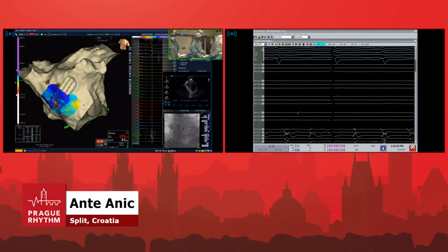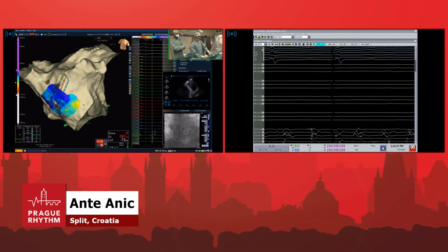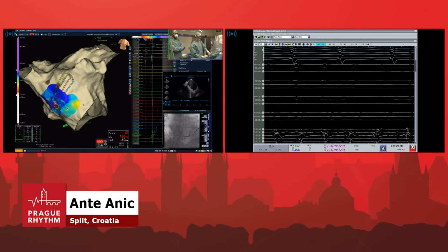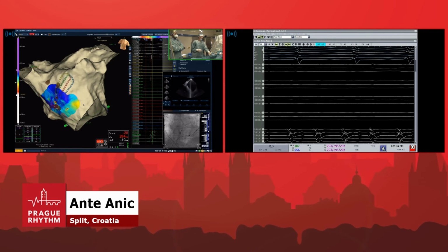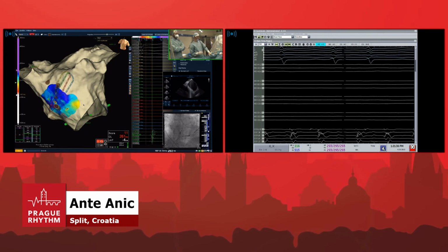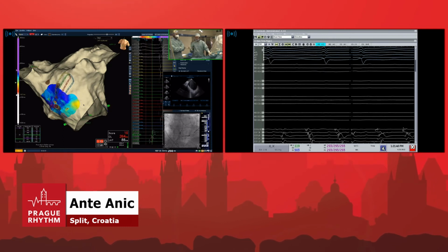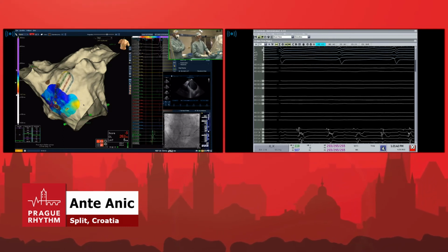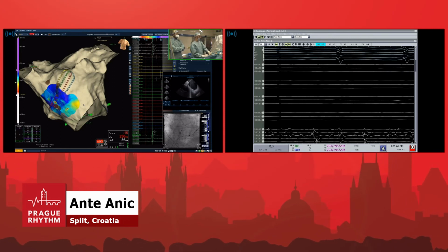But I agree with you that, and it's an operator sense. You have to have a good sense of how far you are from the node. And I do agree that we have to pay attention here. So now that we have disorganized rhythm, it's not organized anymore. We are likely having something closer to AF, because she's on amiodarone or whatever. So now it's our call whether we finish the procedure here and see how this is AFib.